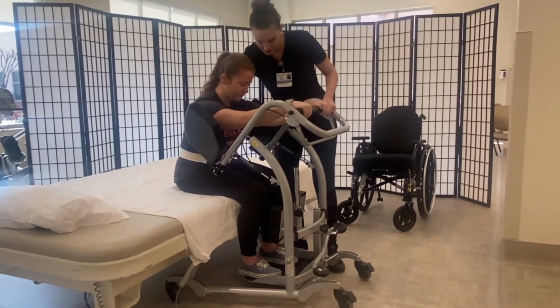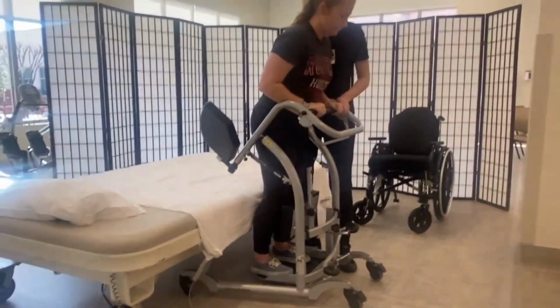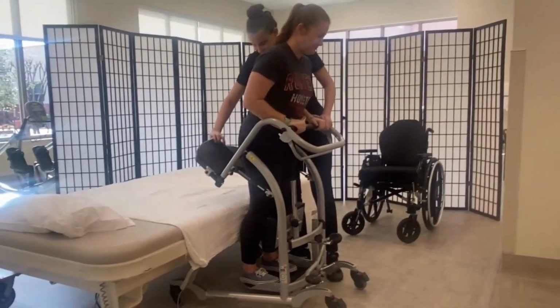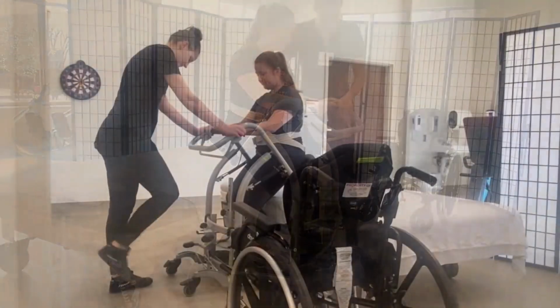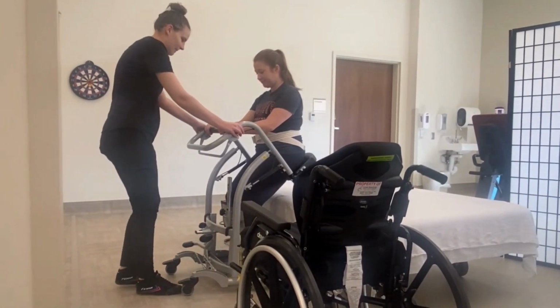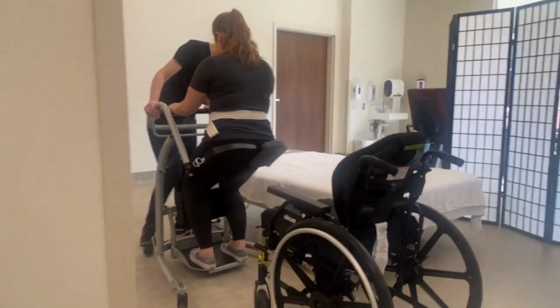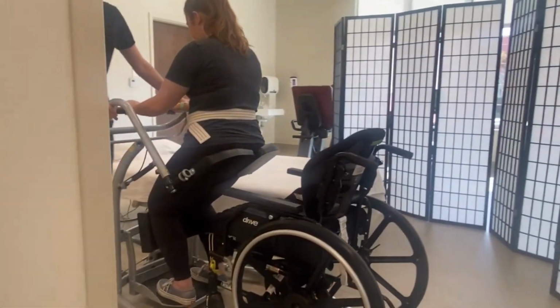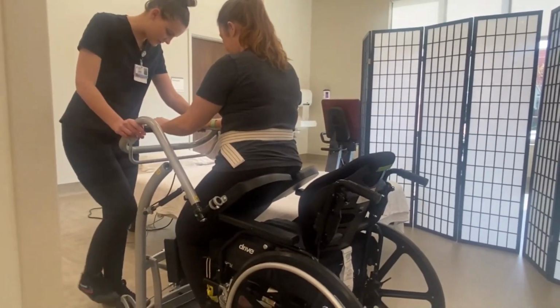The patient is then assisted to a standing position as the seat is positioned underneath the patient. The patient can then sit on the stander seat, and the device can be unlocked to allow for transition from one place to another, like a bedside commode or a wheelchair. This device requires the patient to be able to stand for long enough to get the seat underneath them.